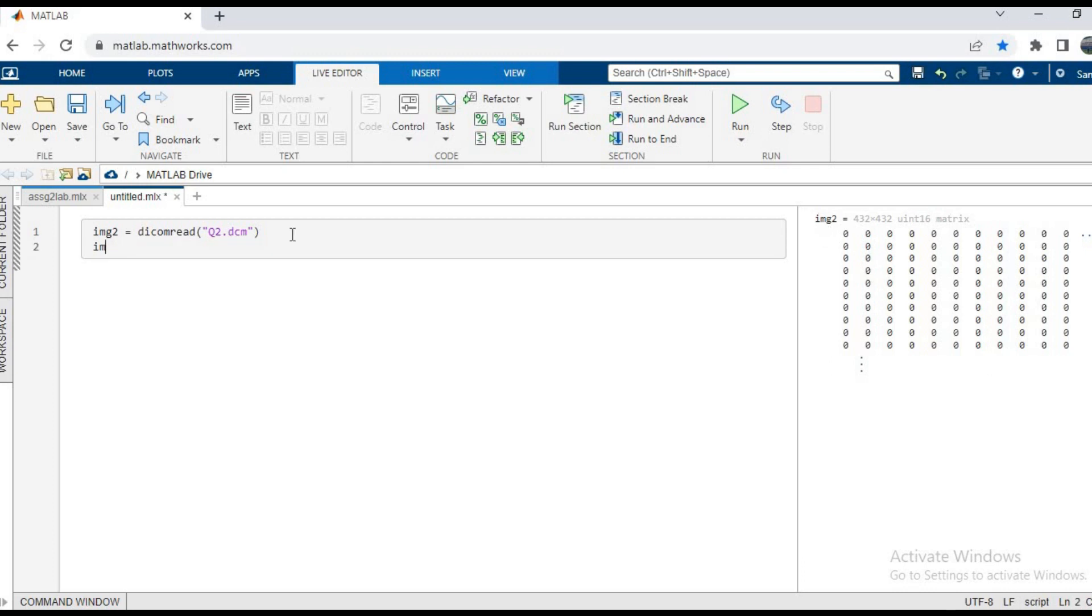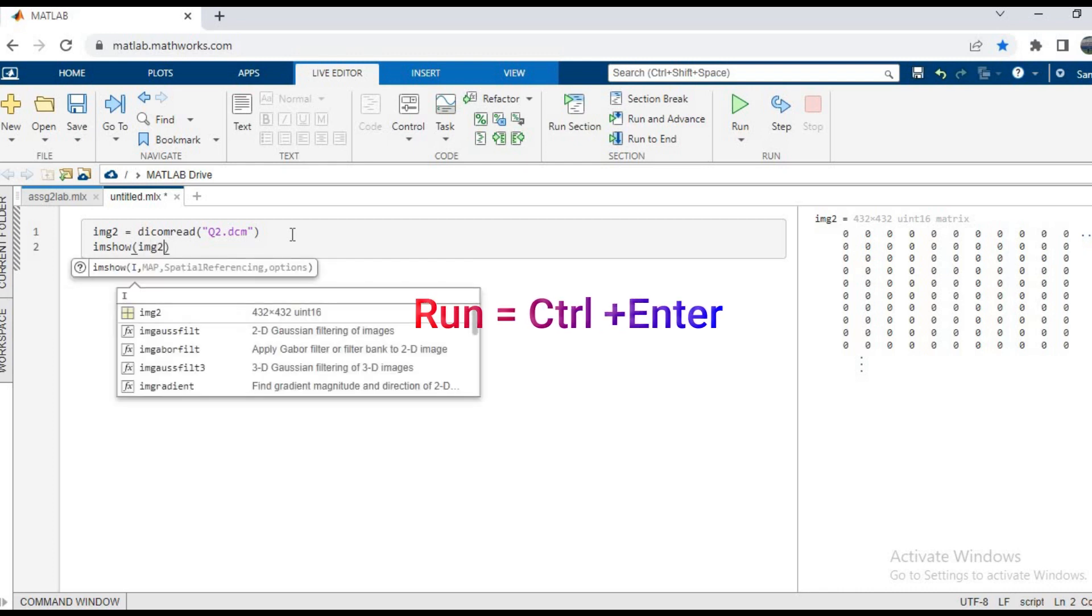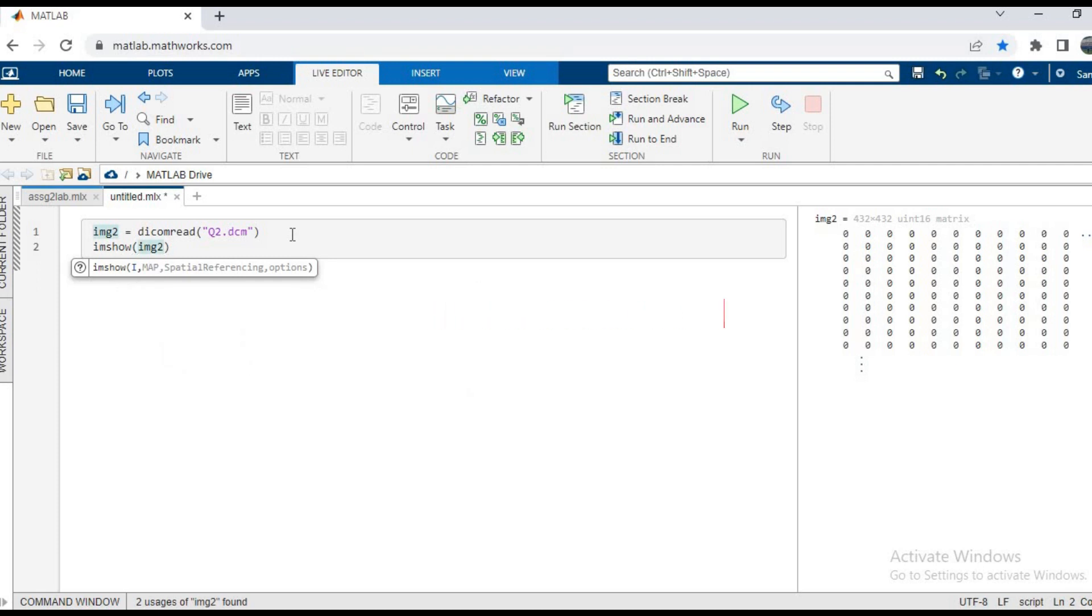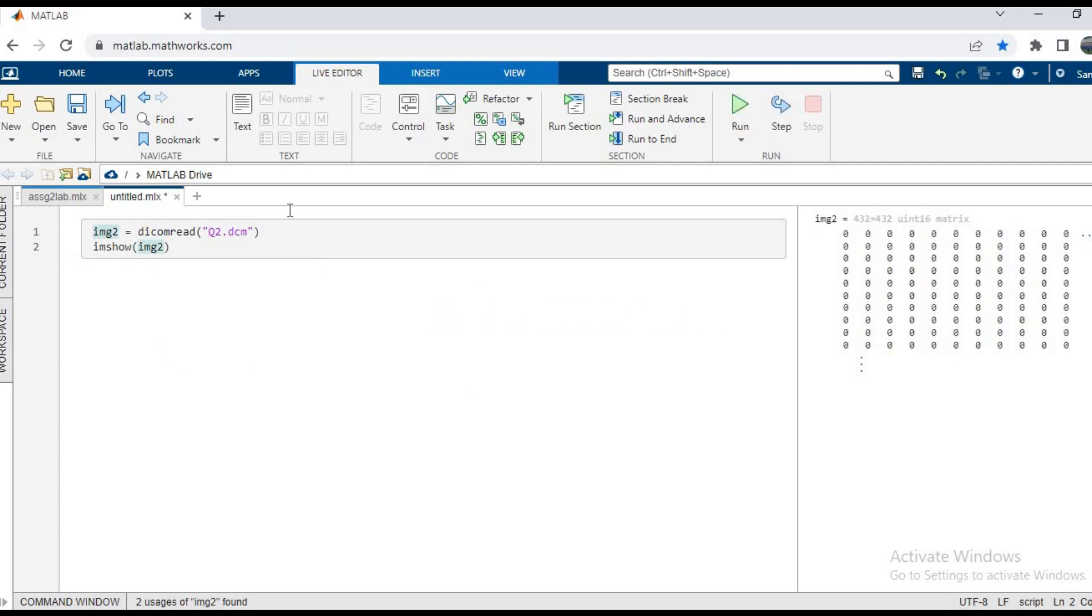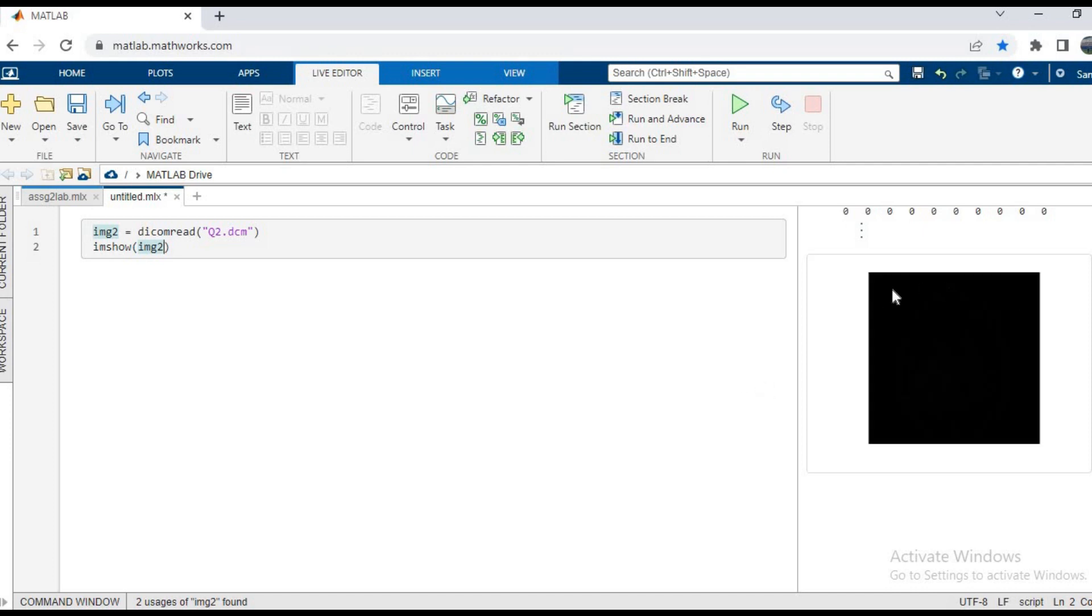So for running, we have another option, that is the keyboard option of Ctrl plus Enter. So I'll press Ctrl Enter, and as you can see that this is a black image.